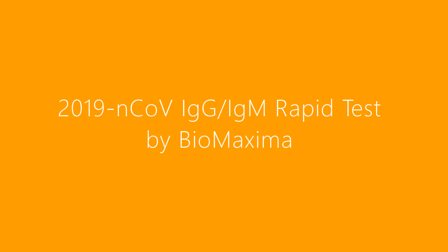The Antibody Rapid Test provided by BioMaxima is a very simple test for the qualitative detection of specific antibodies to coronavirus in human whole blood, serum, or plasma. The test result will appear in 10 minutes.